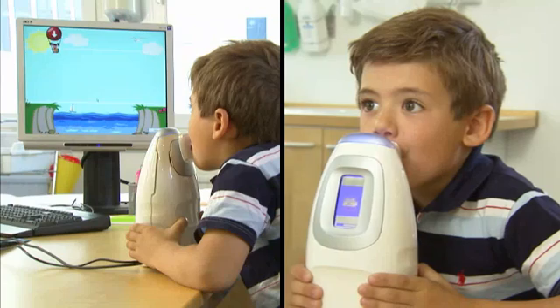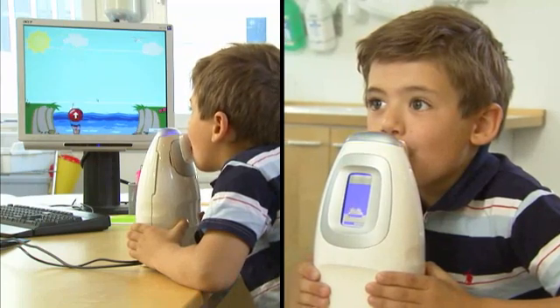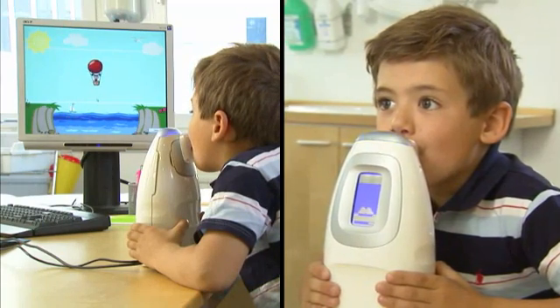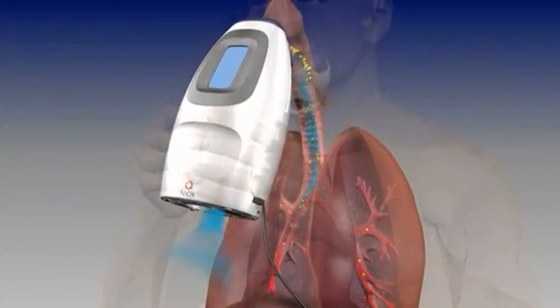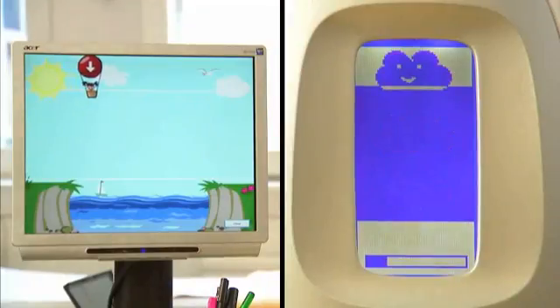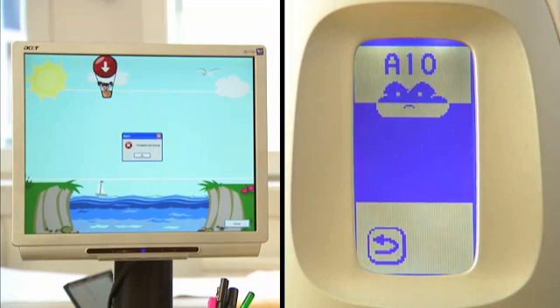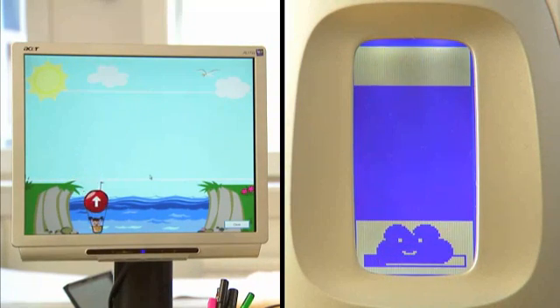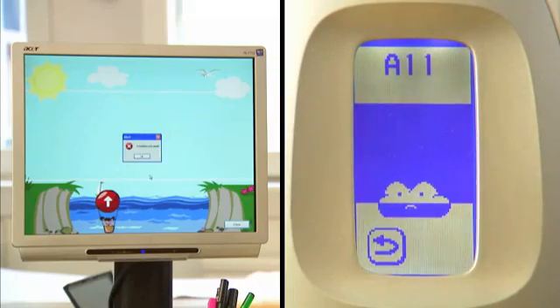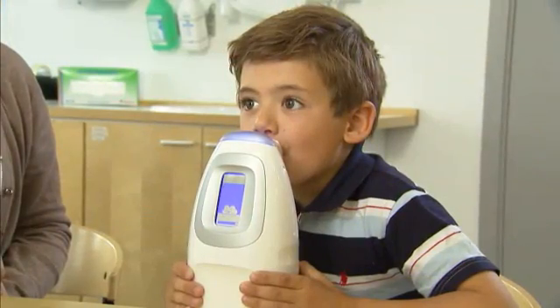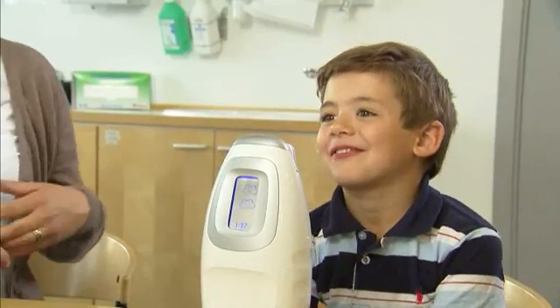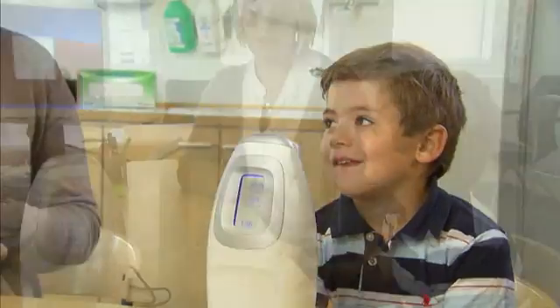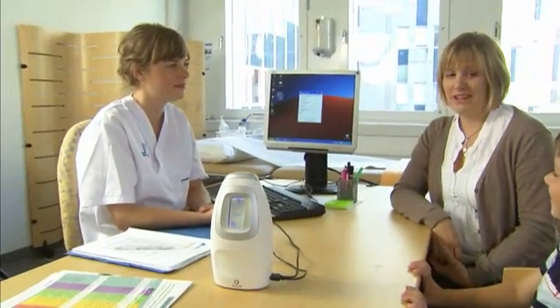Then ask the patient to exhale slow and steady through the filter. The procedure can be followed by either audio or visual feedback. Should the exhalation be too strong or too weak, the device will alert you and the patient. A click sound informs you that the measurement was successful. The device will now analyze the sample and within minutes you'll have the result.